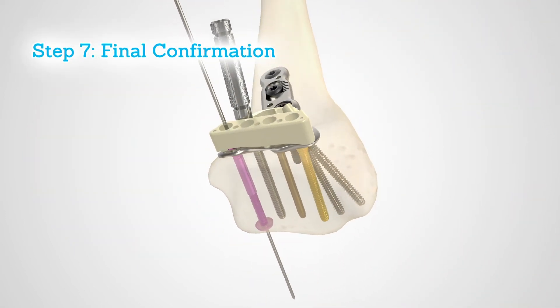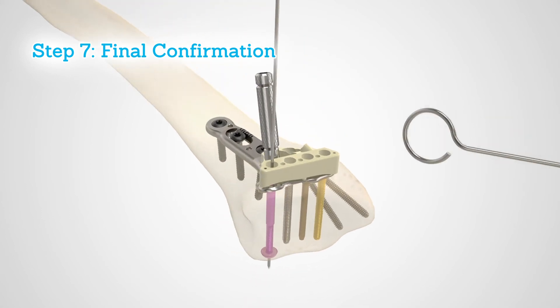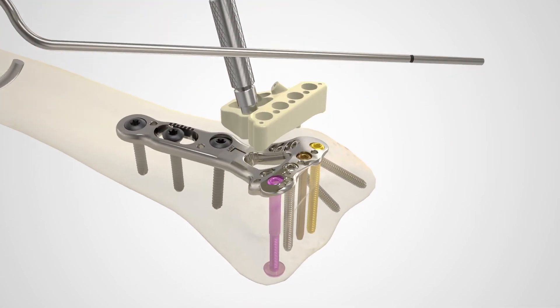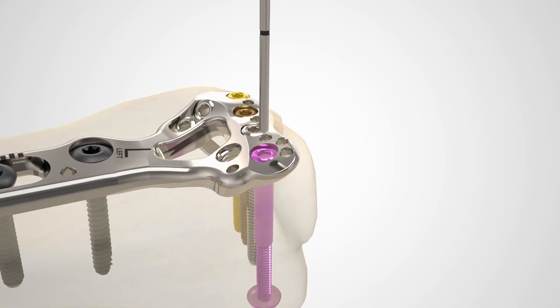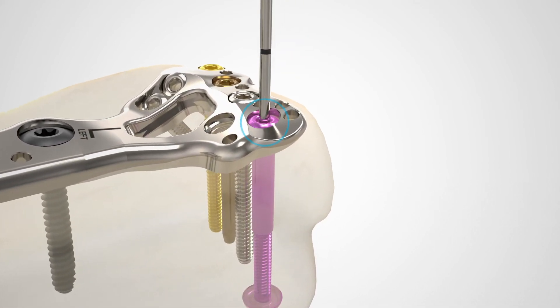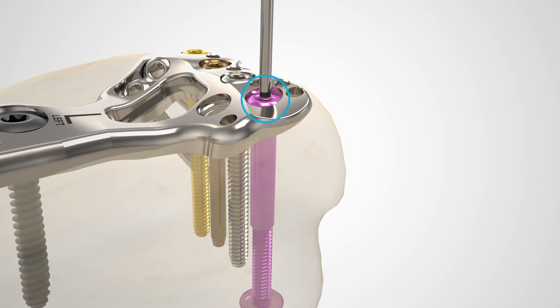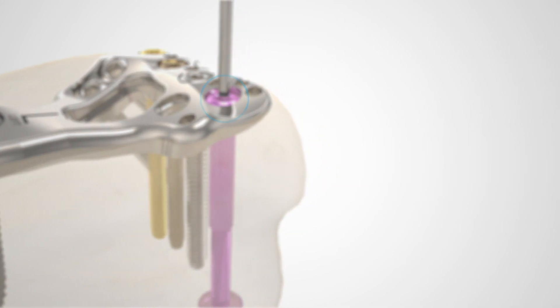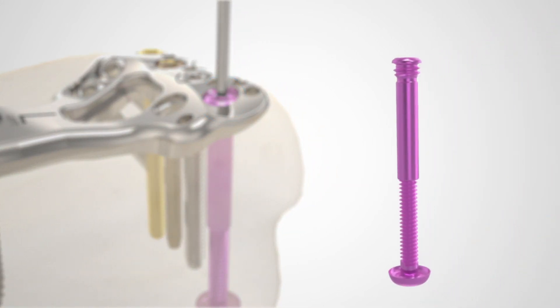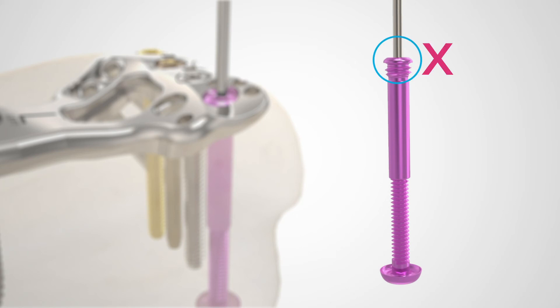Remove the targeting guide and use the FragLock depth gauge to ensure that there is the recommended amount of thread engagement between the FragLock compression screw components. The laser band on the depth gauge should be visible when inserted into the FragLock sleeve. If it is not visible, the FragLock compression screw should be tightened one revolution and then rechecked. Repeat until the laser band is visible.